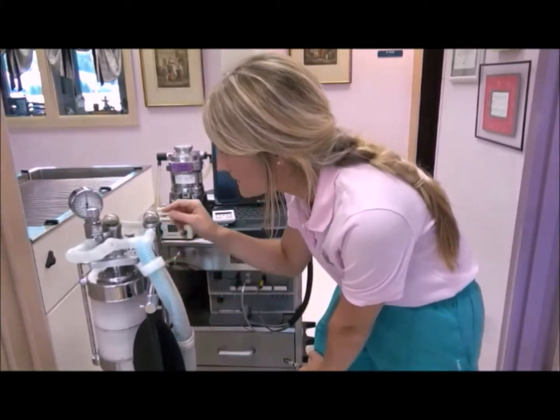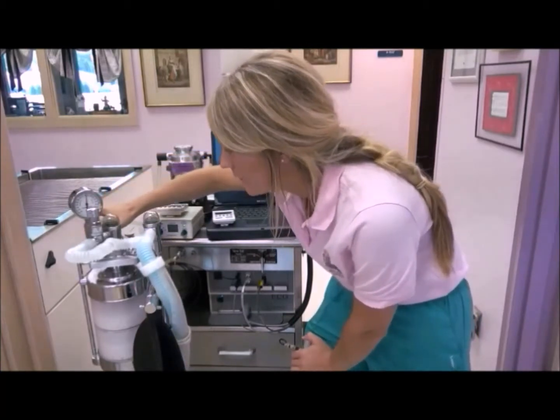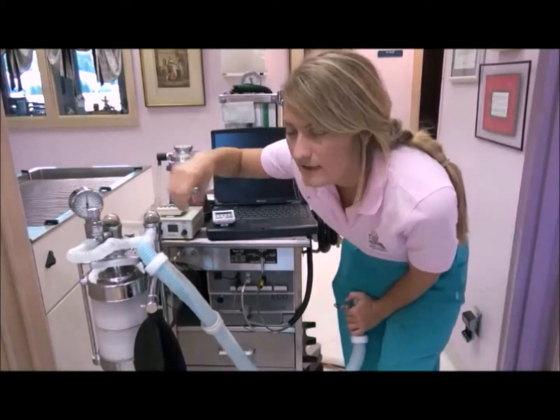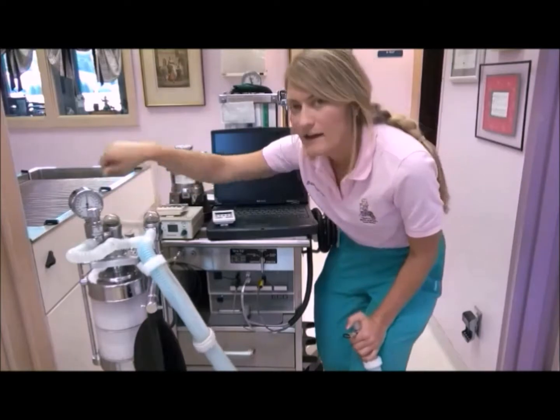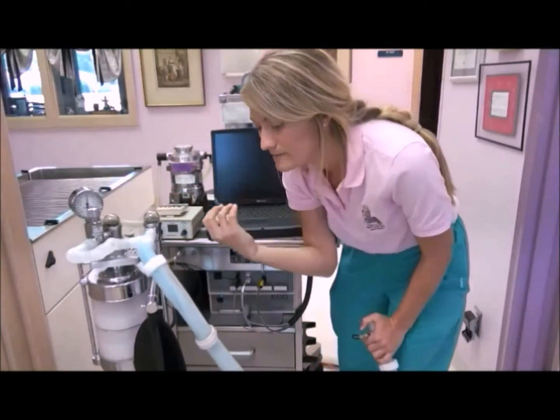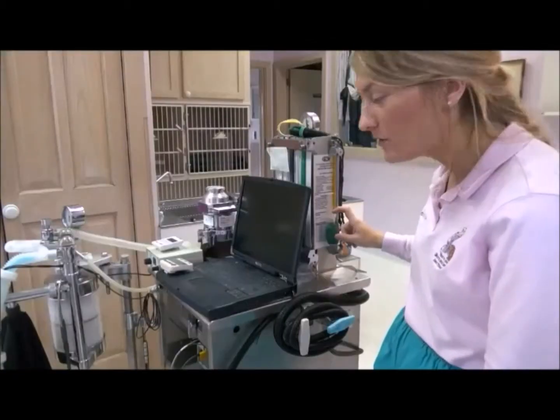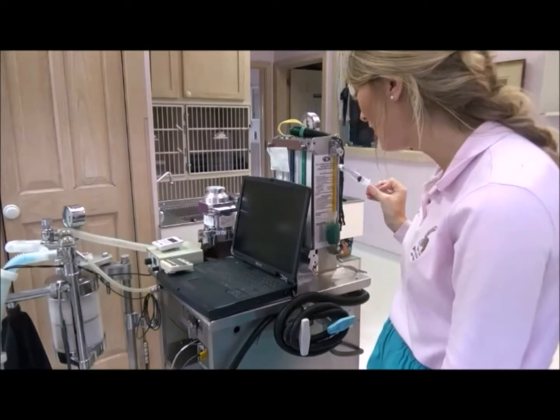From that point, the gases will then exit via, we have an active scavenging system. So it takes the expelled anesthetic oxygen mix out through this tube, and it then exits the building. It basically uses vacuum suction to suck the air out of the building. Here we keep our designated puffer cuffer, as I like to call it.